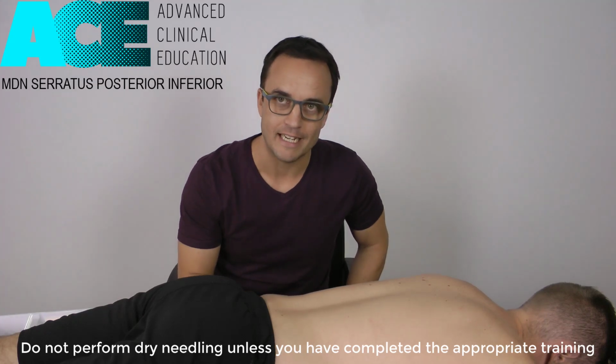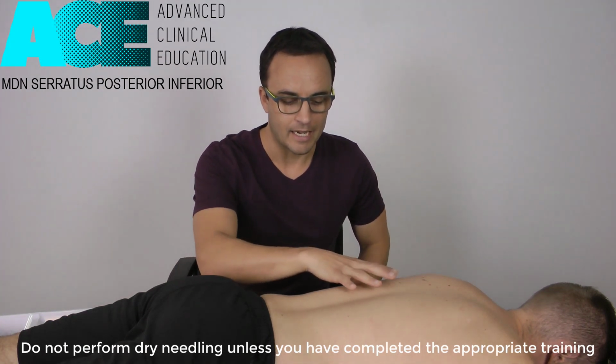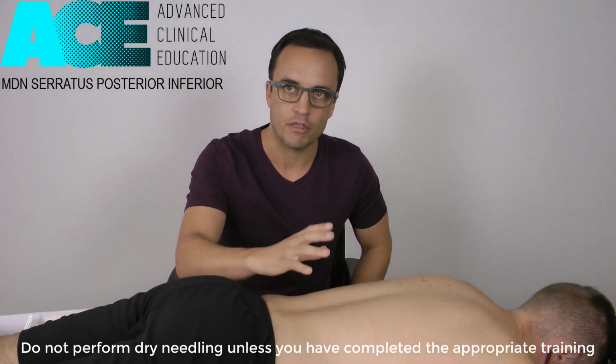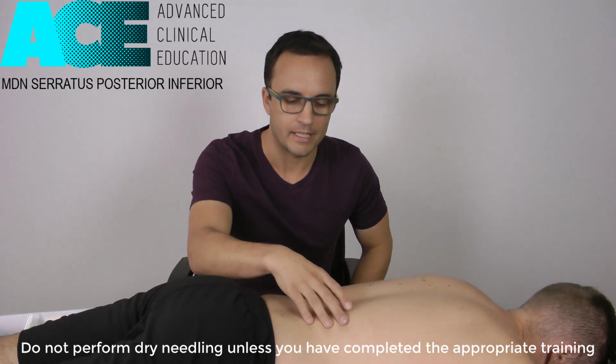About to do a dry needling technique for Serratus Posterior Inferior. This is a muscle that often gets forgotten by us therapists. It's one that covers a reasonable amount of space in our lower back area. It's heavily involved with thoracolumbar rotation and stabilization through the lower back as well. When it gets very tight, we do tend to lose a lot of rotation in that space.